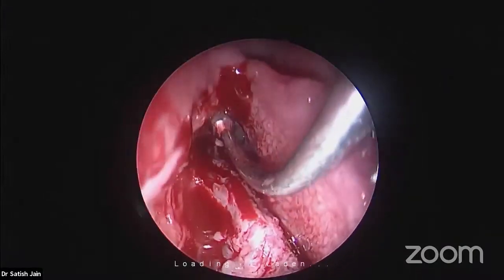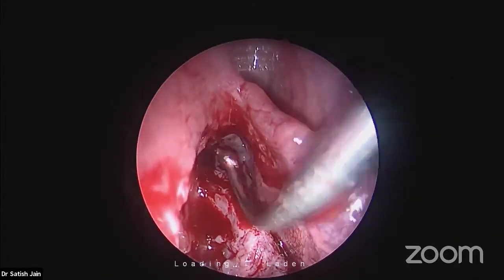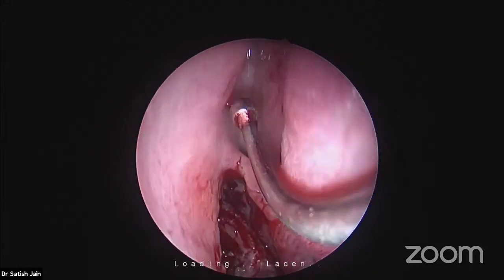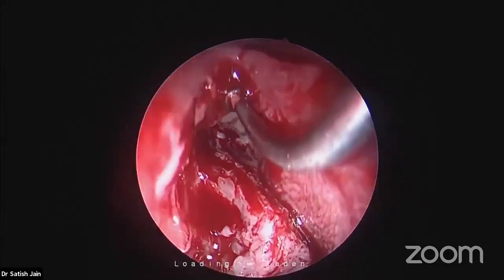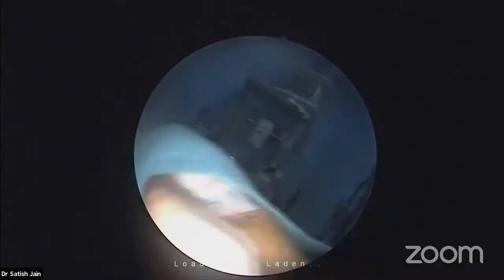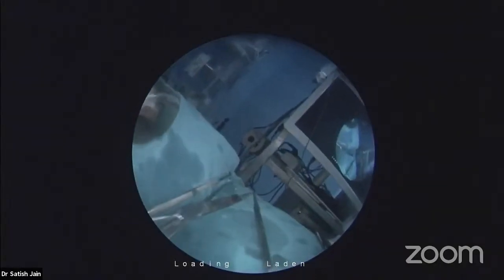See, this is the floor of the frontal sinus. This is all the floor. Here is all the frontal sinus, right from anterior to posterior. And this floor is formed by this beak. This is the beak. Give me a small merocel to show you clearly. Let me show it clearly.